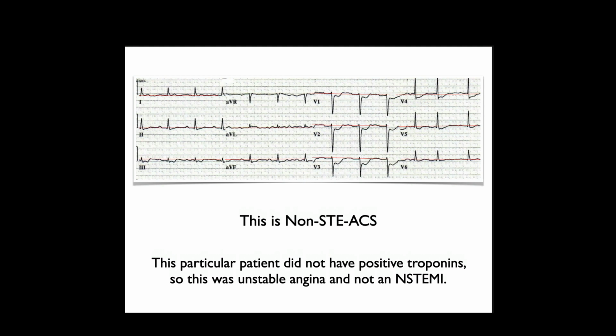That being said, just out of curiosity, I'm leading you down this path of telling you what to think here, but what else is suggested possibly by this 12 lead? What do you think? Posterior. Yeah, this actually could be.